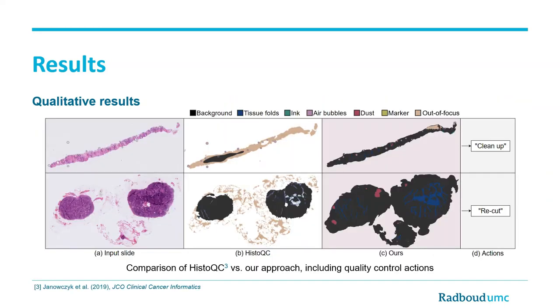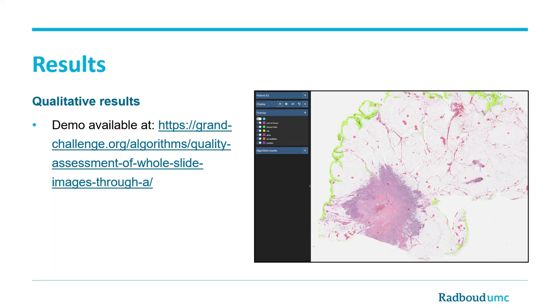We also compared the slide-level performance of our artifact segmentation module with that of HistoQC, an open-source quality control tool for whole-slide images. Our approach seems to include more of the useful tissue regions and segment several artifact types, such as tissue folds, out-of-focus, and dust, more accurately. A demo of the segmentation network is available via the following link, where you can use an interactive viewer to explore the predictions made by the artifact segmentation module on a few example whole-slide images.